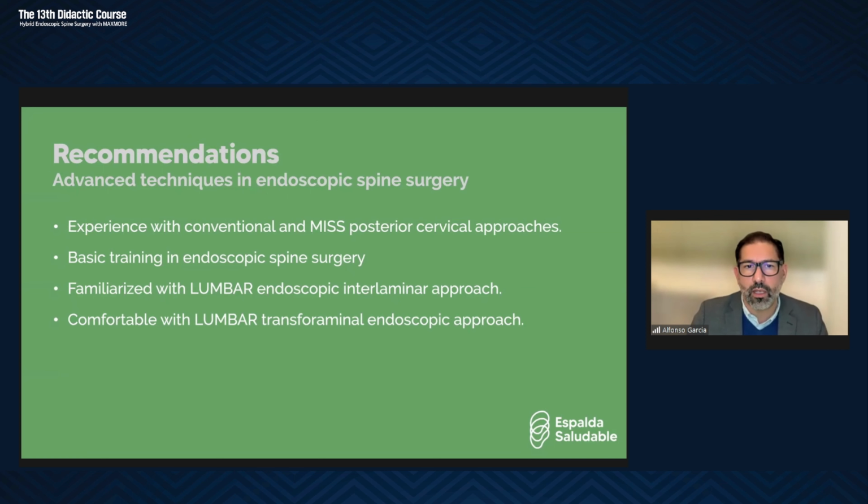So my recommendation for surgeons who are starting with endoscopic techniques is that this is an advanced technique in endoscopic spine surgery. This means that it requires experience with conventional and MISS posterior cervical approaches. You have to go through a basic training in endoscopic spine surgery. You have to be very familiar with the lumbar endoscopic interlaminar approach and feel comfortable with the lumbar transforaminal endoscopic approach. The last 2 will train you for instrument handling because the interlaminar approach is very unstable.